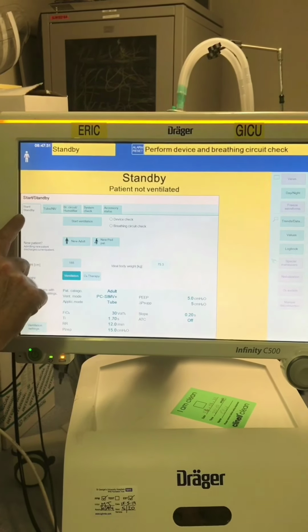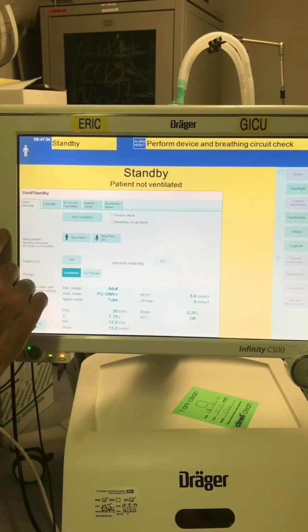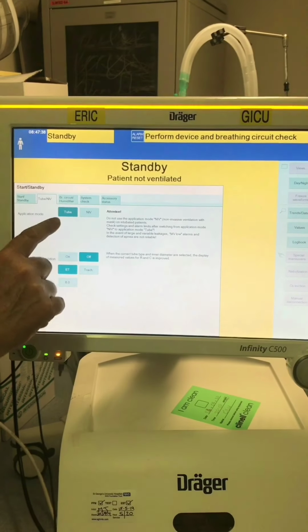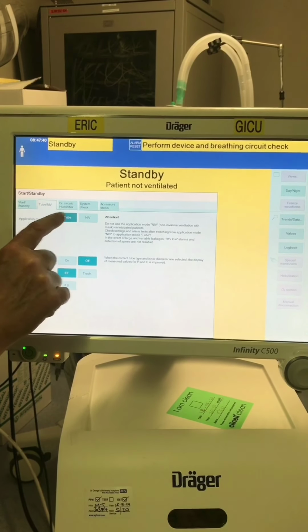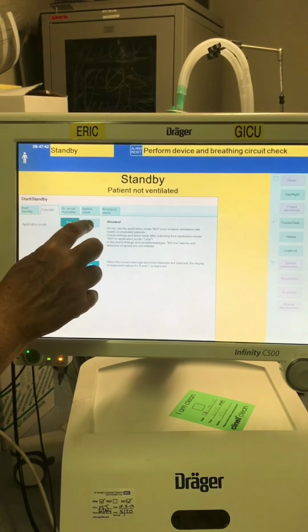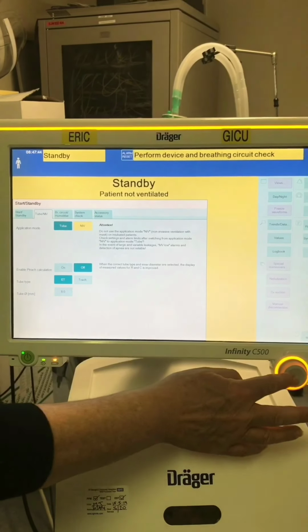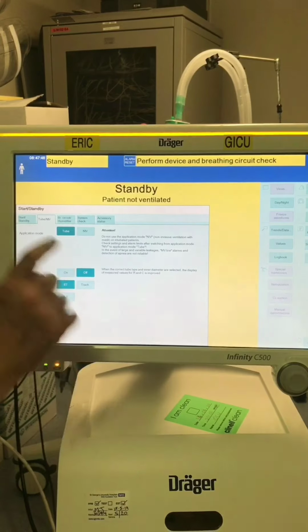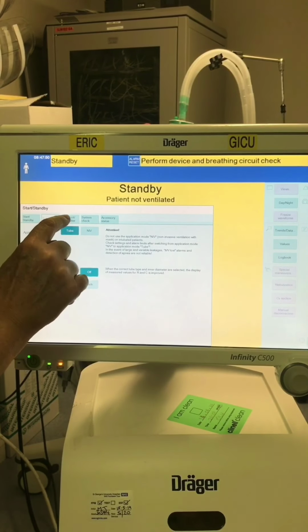So the first part starts standby, new adult. If I now go to tube NIV, I can either place my ventilator in a tube mode or NIV mode. To change between them, you just highlight and confirm. The next one along is my breathing circuit humidifier.